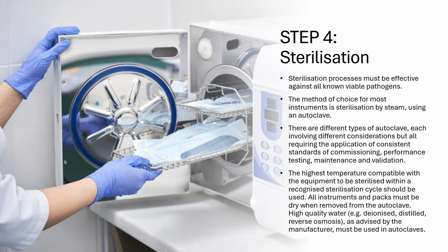There are different types of autoclave, each involving different considerations, but all requiring the application of consistent standards of commissioning, performance testing, maintenance and validation. The highest temperature compatible with the equipment to be sterilized within a recognized sterilization cycle should be used. All instruments and packs must be dry when you remove them from the autoclave. High quality water should be used, like deionized or distilled, reverse osmosis, etc., as advised by the manufacturer. Always use the manufacturer's instructions.